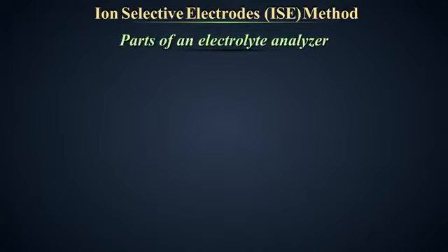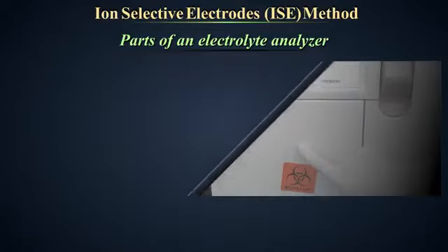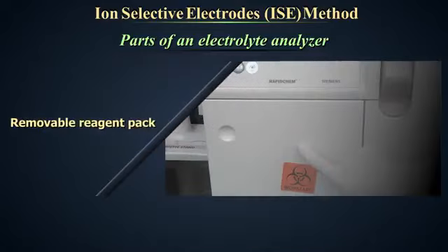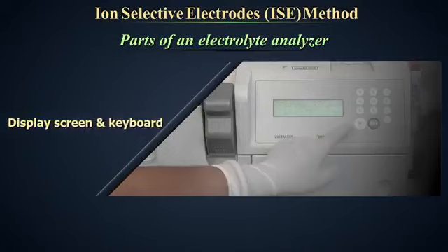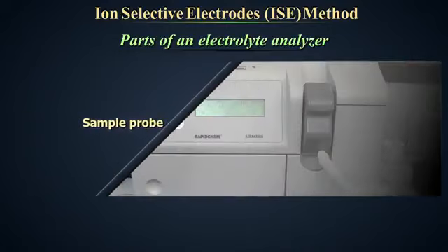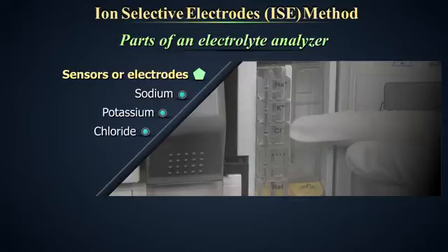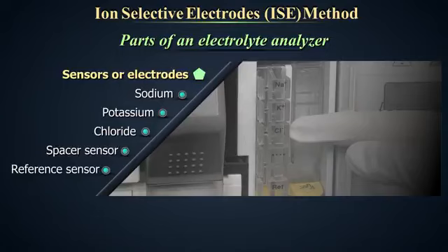Parts of an electrolyte analyzer. There are various electrolyte analyzers available in the market from different manufacturers. The following parts are common to most analyzers. Removable reagent pack, display screen and keyboard, sample probe, sensors or electrodes such as sodium sensor, potassium sensor, chloride sensor, spacer sensor, and reference sensor.